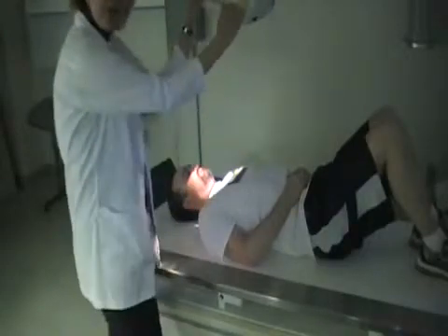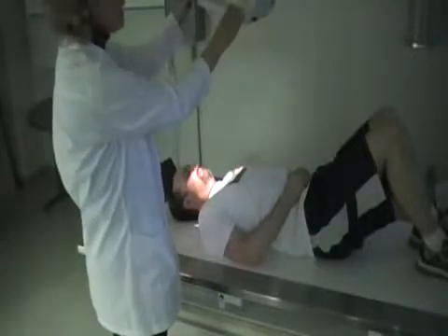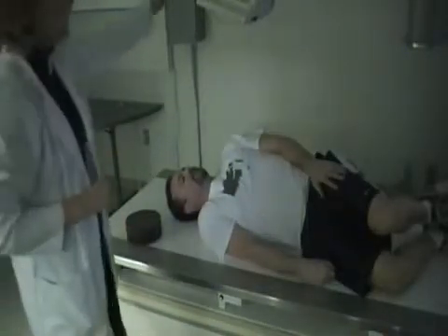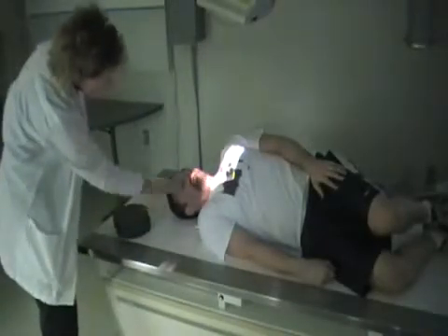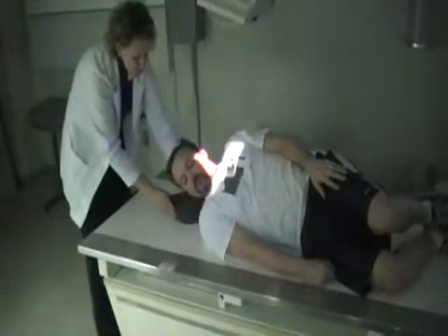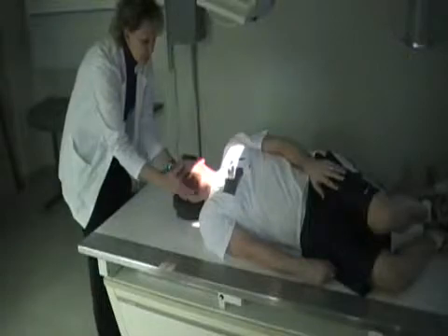Now we're going to do both of our obliques. Our obliques involve a 15 degree to 20 degree angle. Now we're going to do the right oblique first, so have your patient turn 45 degrees, and if it's the trauma patient, go ahead and put that angle sponge behind them to keep them in place. Okay, now you can see how the head is angled down, and I want the head to be at a nice even plane with the rest of the body. So I'm going to put some sponges underneath his head, and then I'm going to bring the chin out.